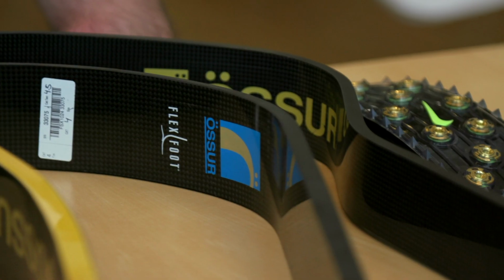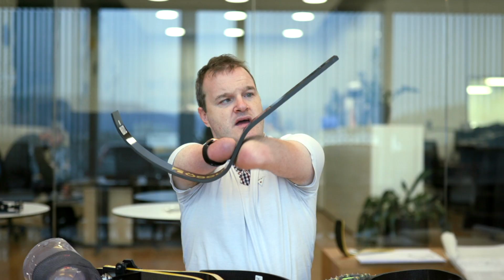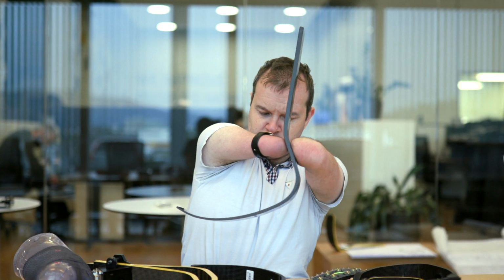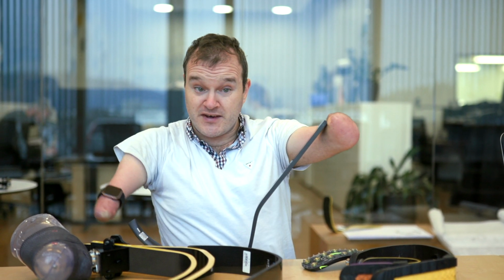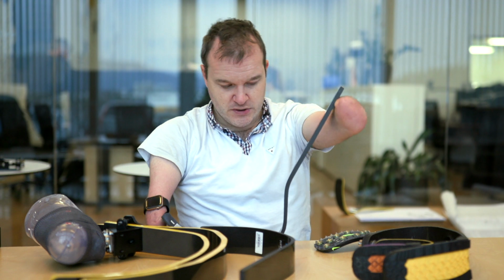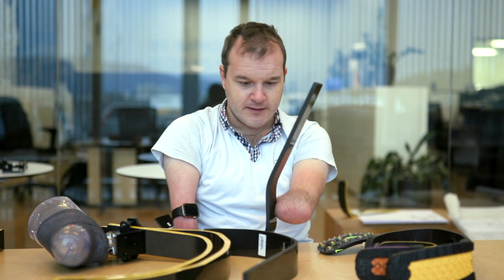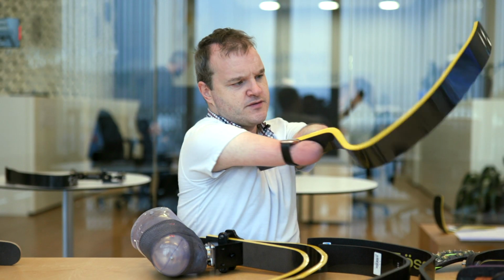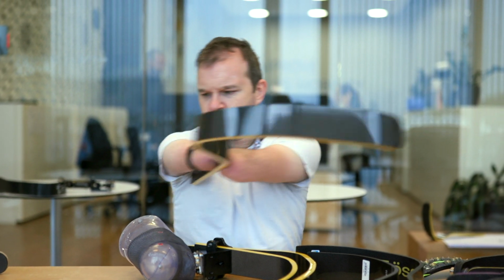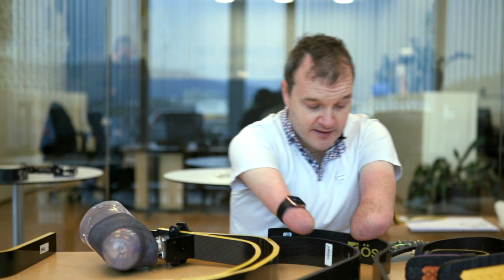And then from there we progressed to this one, which introduced this bend in the backside, which spreads the load when you're actually pushing down. It spreads the load. They don't look that flexible because I'm not strong enough to bend them, but these actually take quite a lot of force, and all of that force is distributed along the back here. And fast forward right up to today's Cheetah Pro, which is this one, it's not a million miles away, but it's come through quite a few iterations to get there.